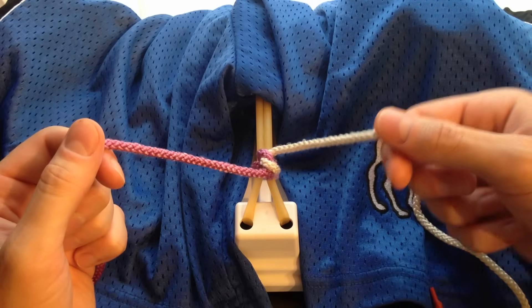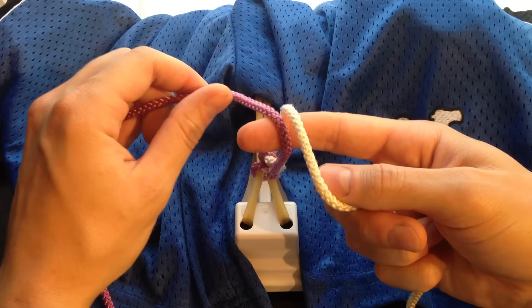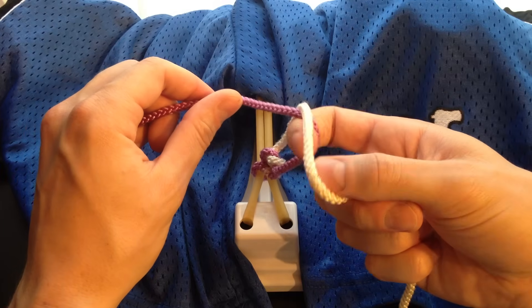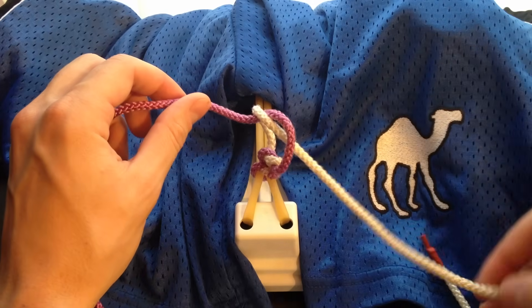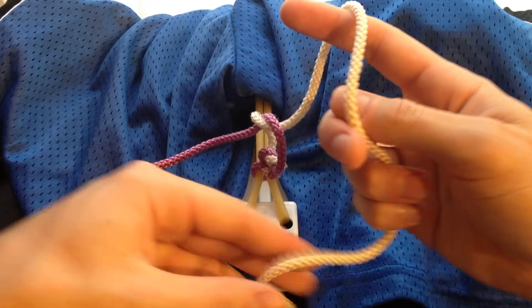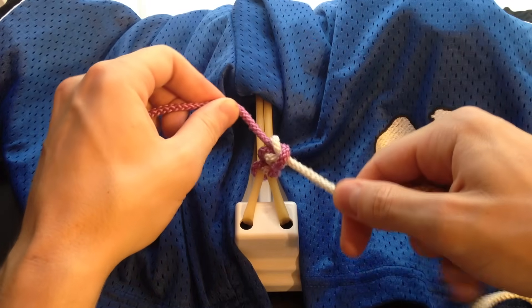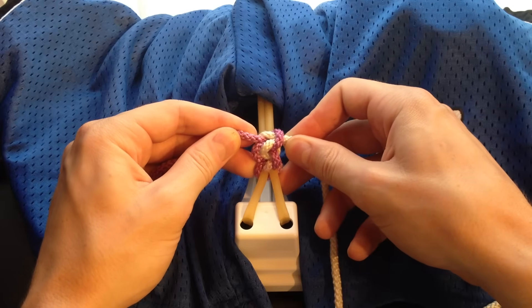Let's tie the second knot. Start with the claw. Drape it over. Go over, under. And rotate it through. Now, with the claw, this free end is already pointing towards us. So we pull the free end towards us. And when we do that, you can see again that we've got another square knot.